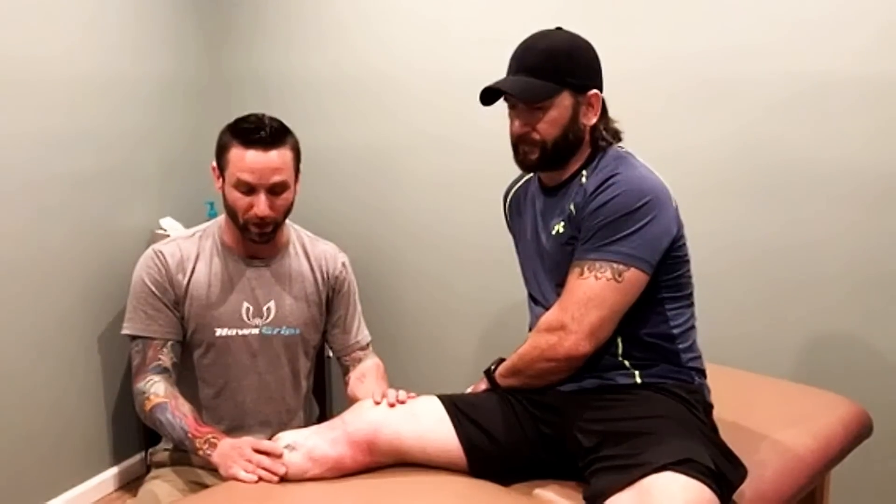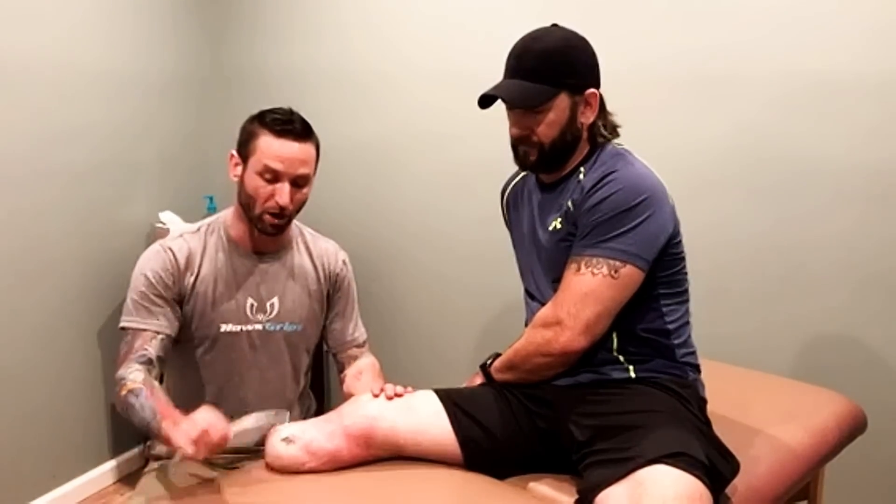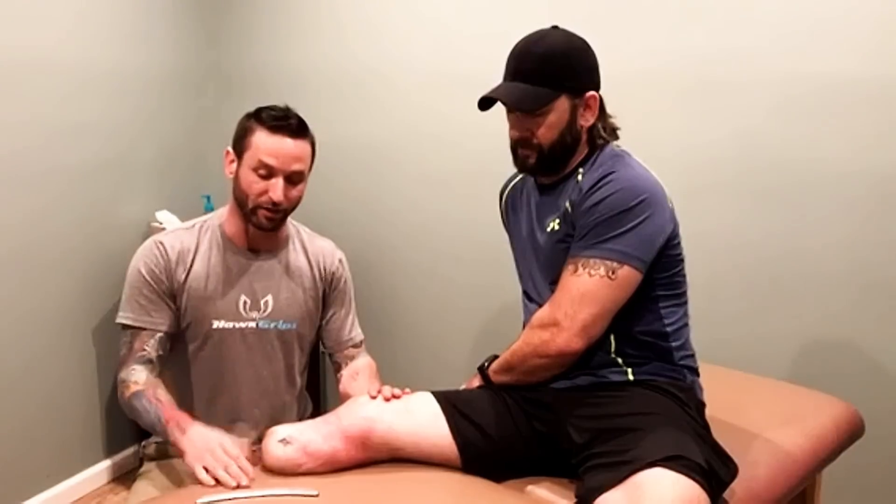He actually came to me for shoulder issues, and I was like, man, you should let me do some work on your leg. He was talking about some chronic muscle spasms and some issues he was having, and it turned into a tremendous success story using Hockard instruments to get the adhesions and scar tissue out and to increase circulation.